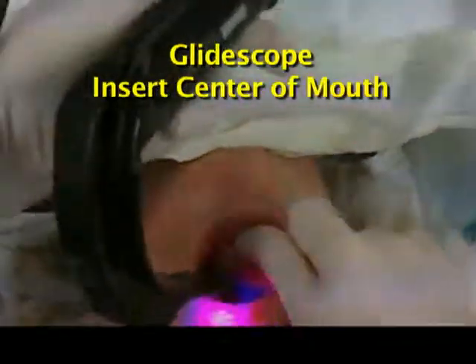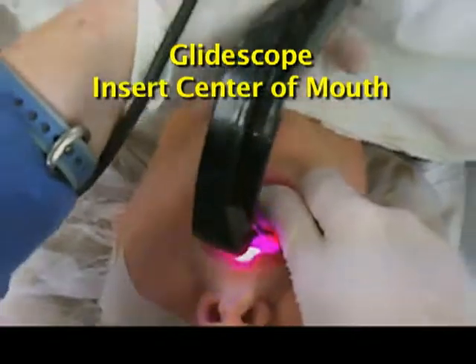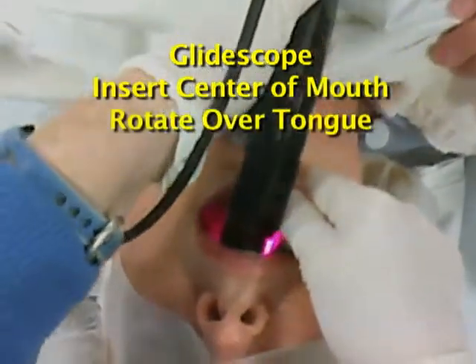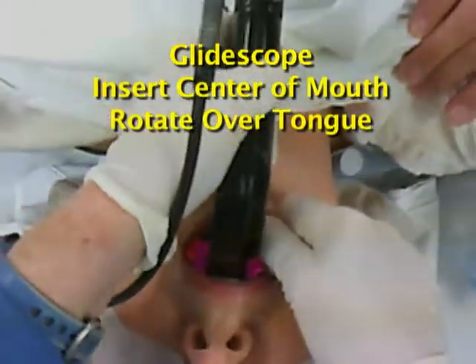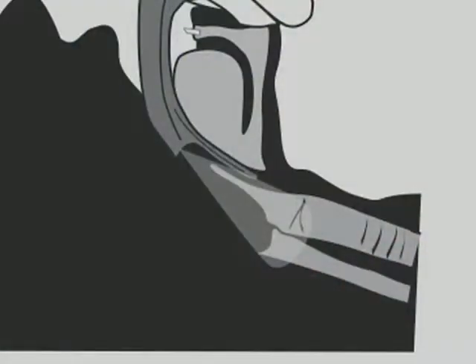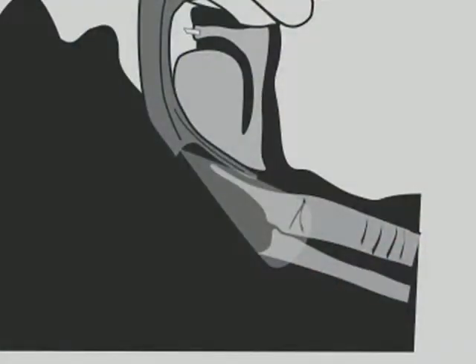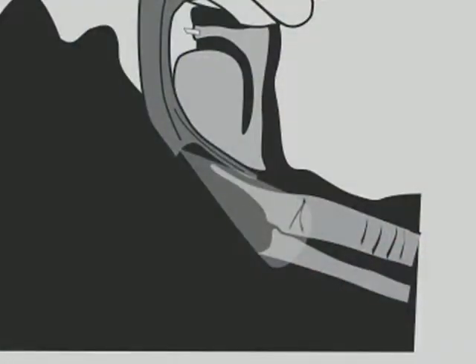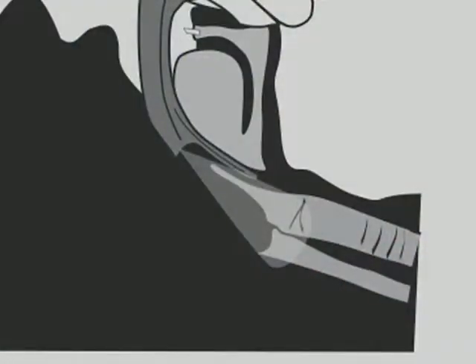Unlike the MAC, the GlideScope should be inserted into the center of the mouth and rotated over the top of the tongue. This position lines up the camera lens, located at the tip of the blade, with the larynx.